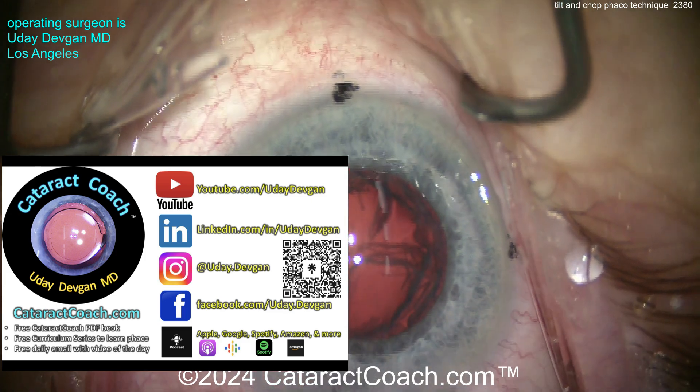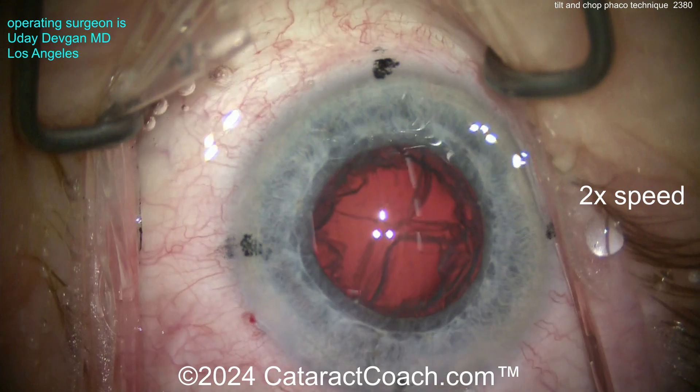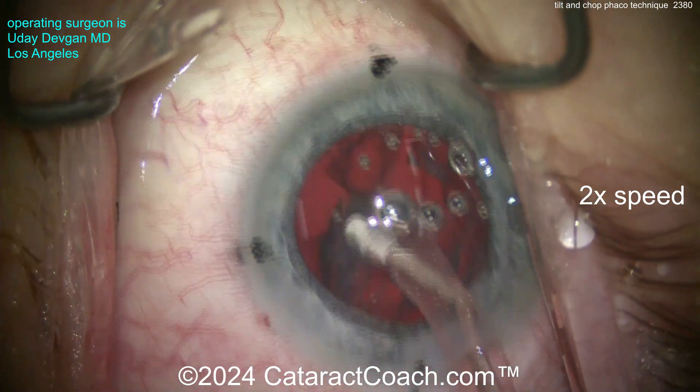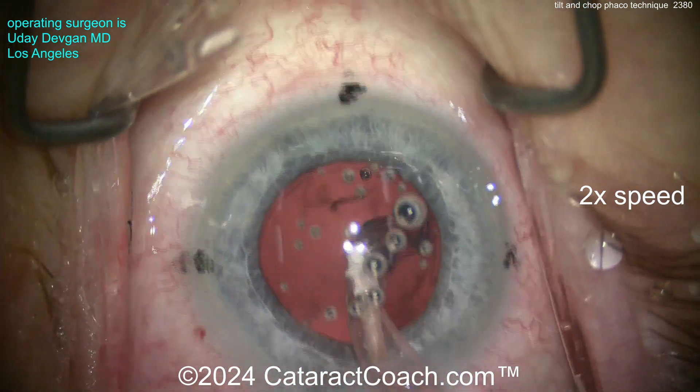Our podcast is the top podcast in all of ophthalmology — it will teach you how to be a more successful ophthalmologist. Now, cortex removal: let's finish up the rest of the case. We've sped the video up to 2x as we clean up the cortex.